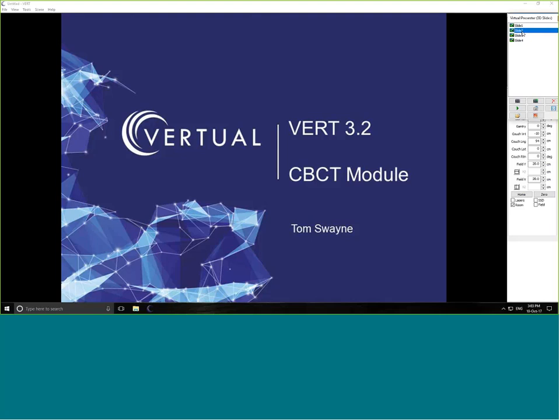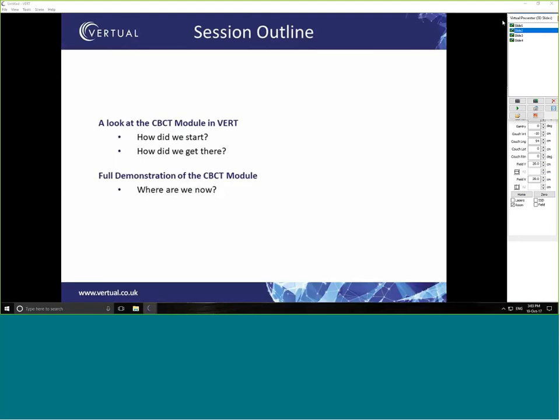So the format of this presentation is that I'm going to give you a bit of background about where we've come from with the CBCT module, how we've got to where we are today, a bit of a breakdown of the timescales, the timeline. Obviously, I'm going to give you a full demonstration of how the CBCT module works. I think we did one this morning, it took roughly around 45 minutes, so that includes a little bit of time for questions at the end.